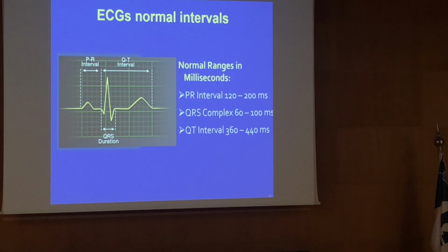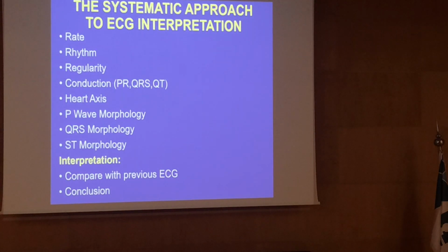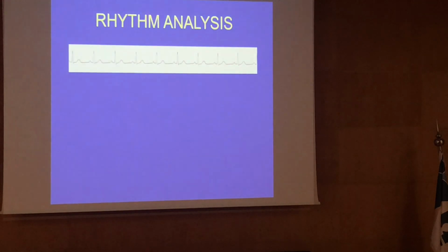So with time, inshallah, by the end of all the ECG lectures, you will have the more common diagnoses that you can reach. So look at the rhythm analysis. How to calculate the heart rate, by the way? How can we calculate the heart rate from the ECG?